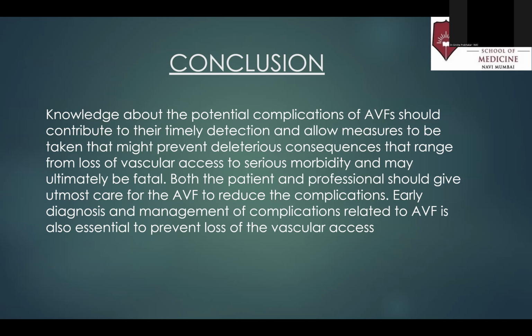Stenosis greater than 50% often needs treatment before it progresses to thrombosis. And number four is comprehensive assessment. Always check the fistula circuit, not just the anastomosis.